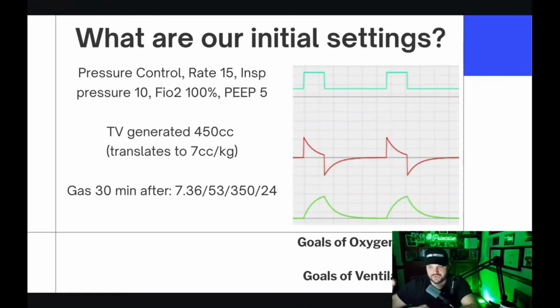And you're going to get a bigger volume. Now that has downstream ramifications because, depending on the mechanics, you would have to figure out what your driving pressure is. So if you needed an inspiratory pressure of 20 to get a volume of like 450, and you're starting at a PEEP of 5, theoretically your plateau pressure would be something like 25. 20 plus 5 is 25. If you wanted your driving pressure, that would be 25 minus 5, which is 20, which is a little bit higher.